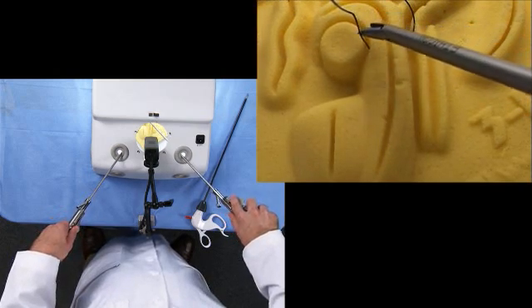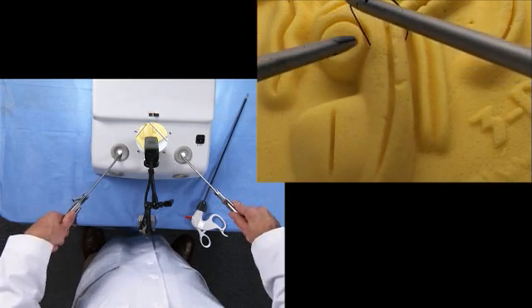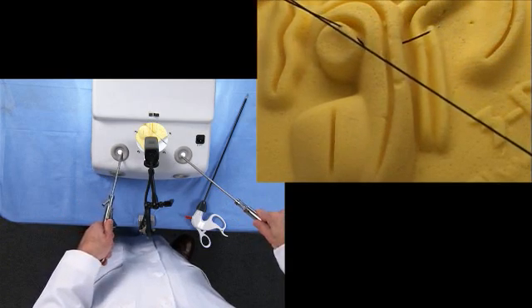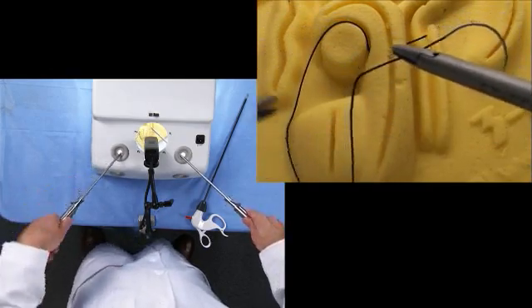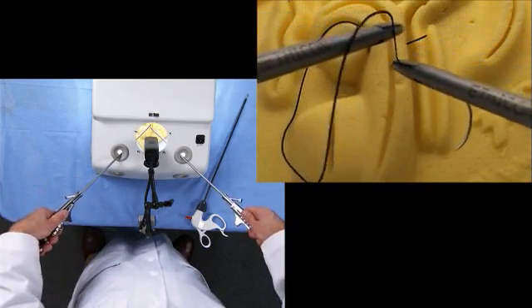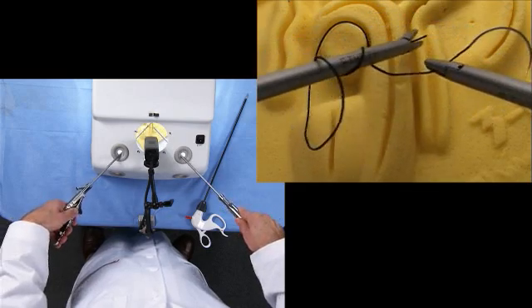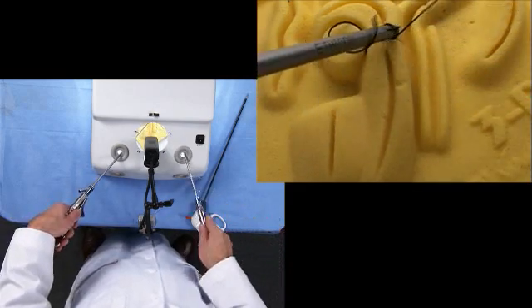Then we'll re-grasp right behind the swedge, use the left hand to pivot out, leaving a short tag. Now the needle's to the right of the needle driver, rotate to create a camel's hump and a second camel's hump. That's two wraps and grab the tag.